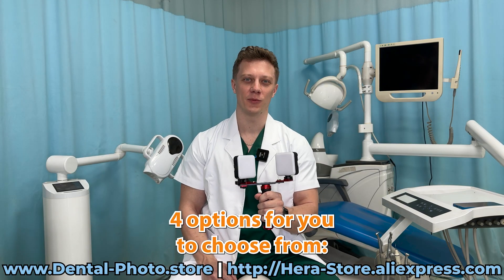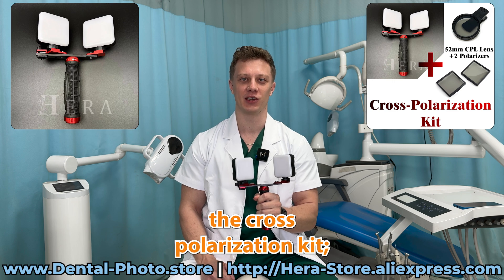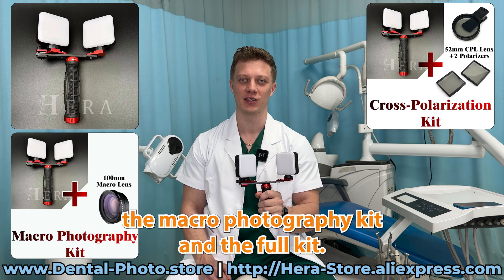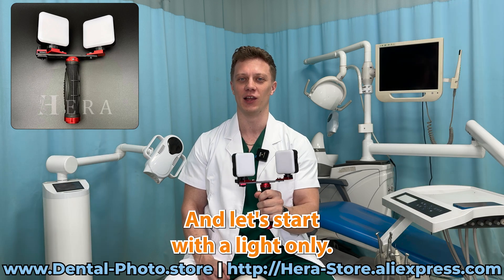First of all, there are four options for you to choose from: the light only, the cross-polarization kit, the macro photography kit, and the full kit. Let's try them all one by one and let's start with the light only.